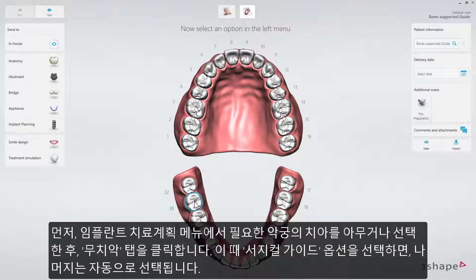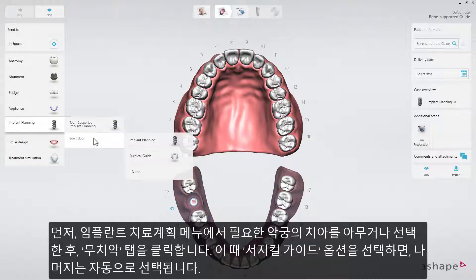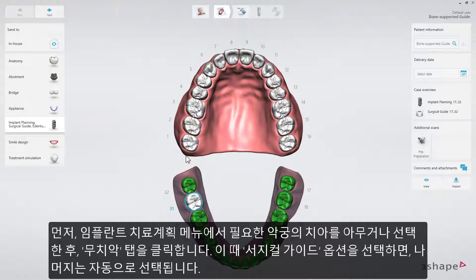To start, select any tooth in the relevant jaw, and from the implant planning menu, choose the Edentulous tab. From here, choose the surgical guide option. The rest will be selected automatically.